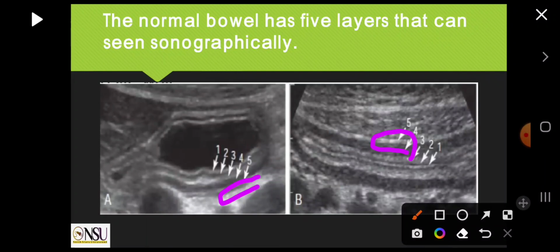Sometimes the patient suffers from abdominal pain and vomiting, maybe sometimes intussusception or volvulus, or maybe, commonly, inflammation in the large or the small intestine. How can inflammation be detected? The inflammation of the large or the small bowel can be detected by the internal layer. Who's the internal layer? The internal layer is the mucosa, which may be inflamed.